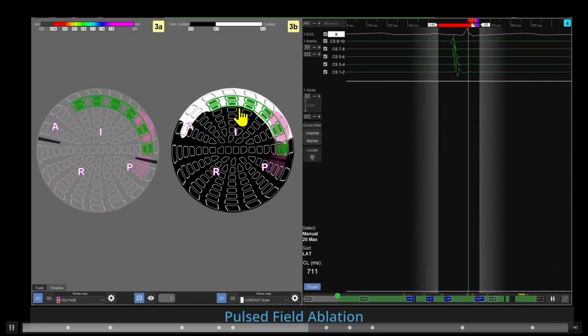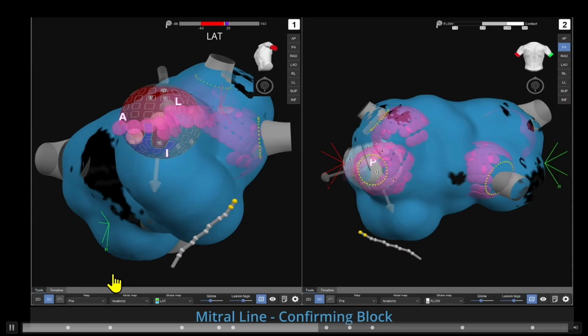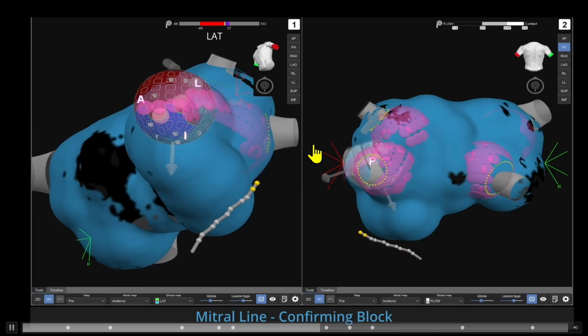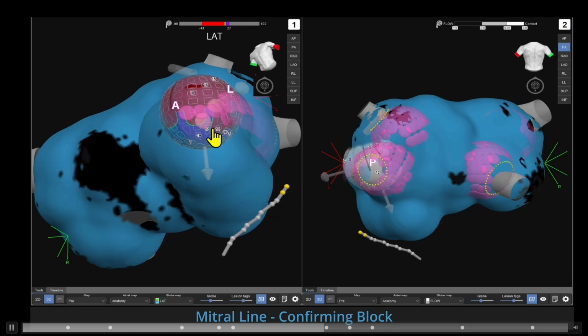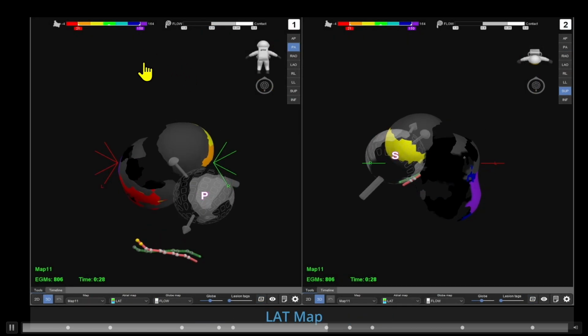And then we pick more, and then we deliver energy. And let's get past this. And then what's really nice is you can pace from the coronary sinus, for example, and look at change in activation. Or you could, if you could put this on right here, you can pace from one side and look at activation on the other side.